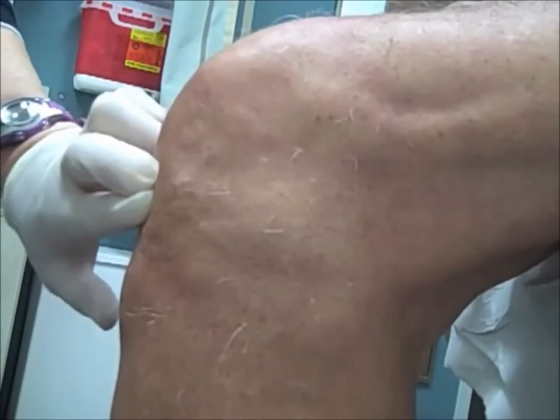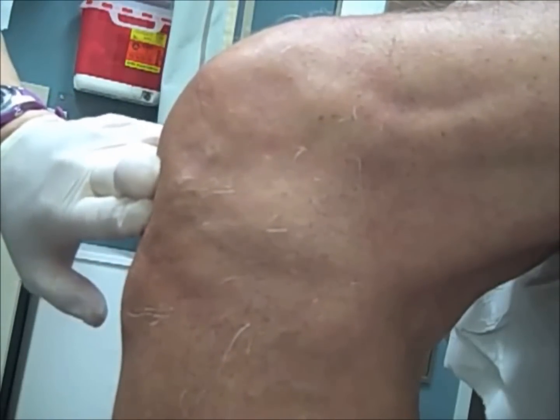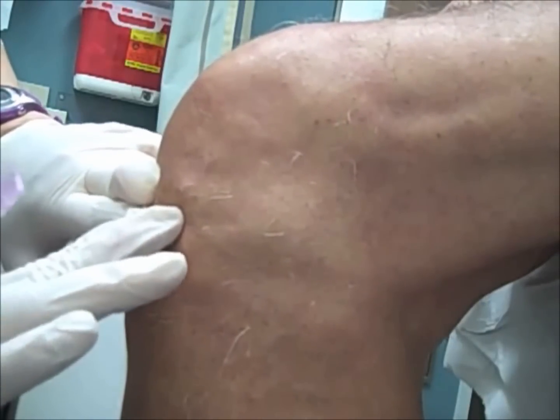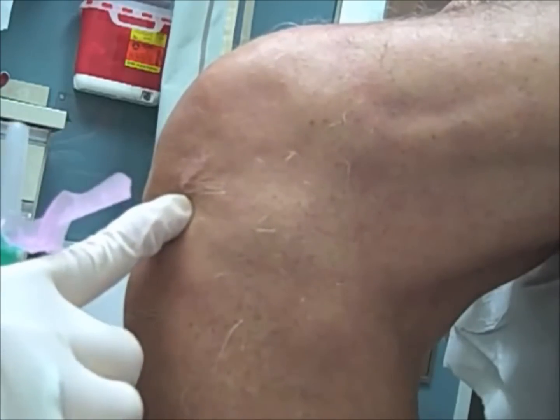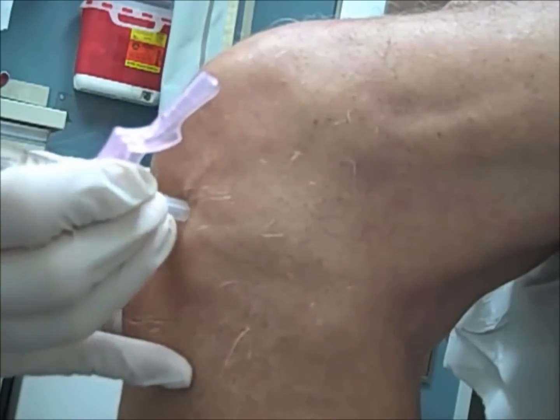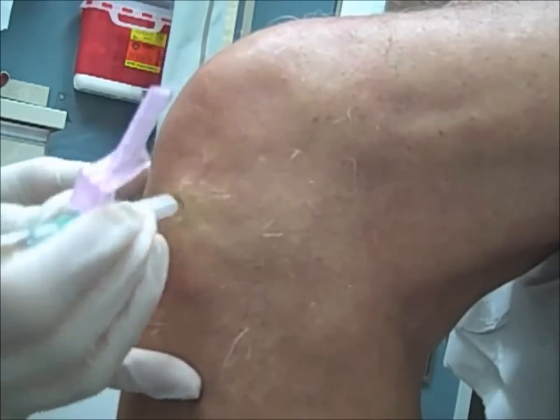So our landmarks will be the patellar tendon and the tibial plateau, and our injection site will be approximately 1 centimeter lateral to the patellar tendon and 1 centimeter superior to the tibial plateau. There's usually a soft indentation at that site, which is where we'll mark for the injection.